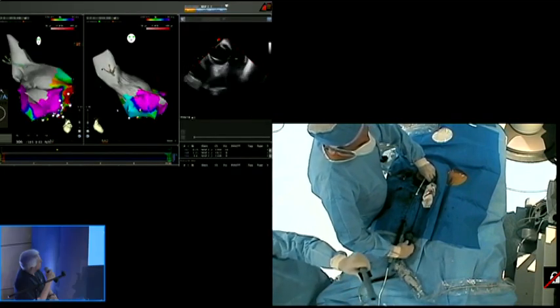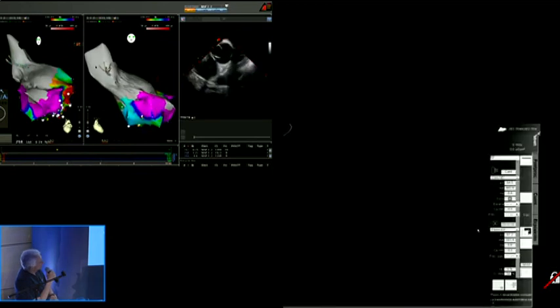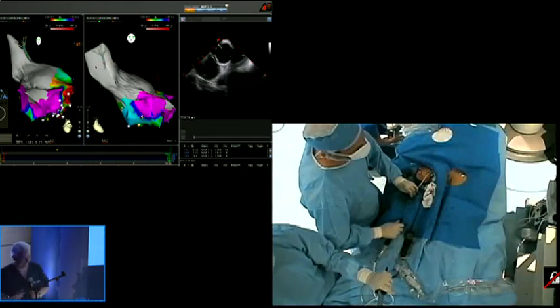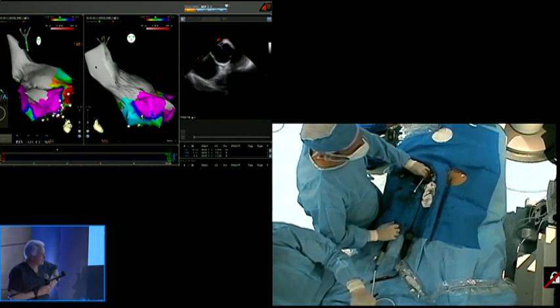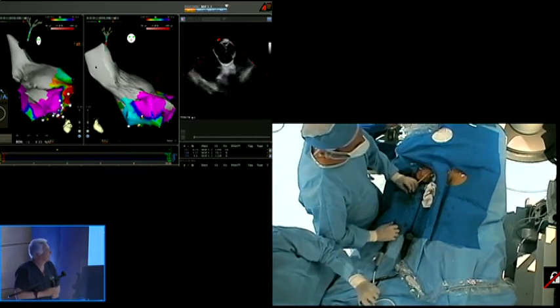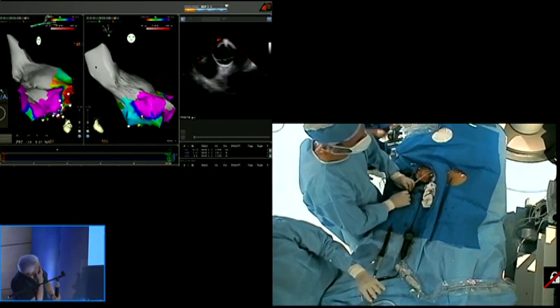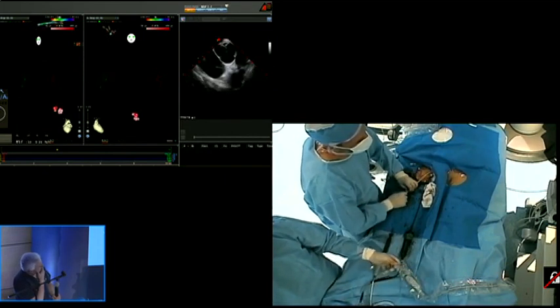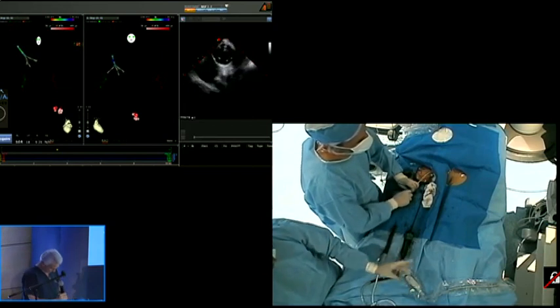We are working without fluoro, Andrea. I know, but a little bit of fluoro doesn't kill anybody. My back. So I have too big a loop here. The pentarray is connected, Diego. I'm gonna pull it back again. I'm gonna get back in the sheath and re-advance.